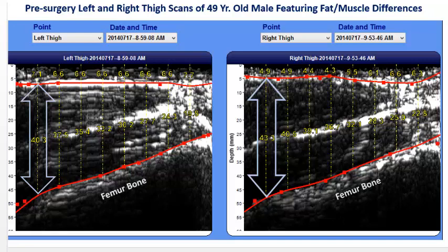In this illustration, we see scans comparing the left and right thigh of a 49-year-old male who suffered both ACL and MCL tears in the left knee requiring surgery. The scans were conducted over a 6-inch vertical segment from the midpoint of the thigh to the patella with the Bodymetrics Ultrasound.